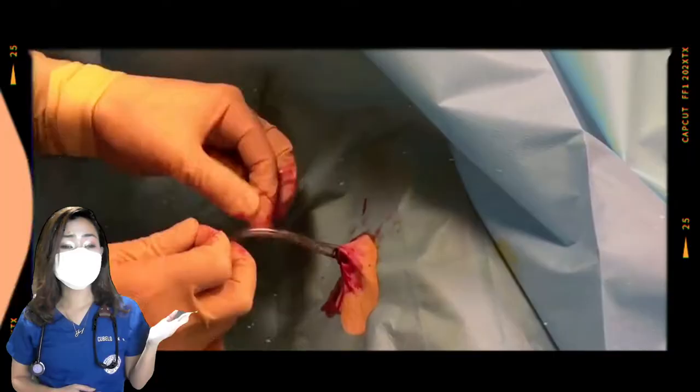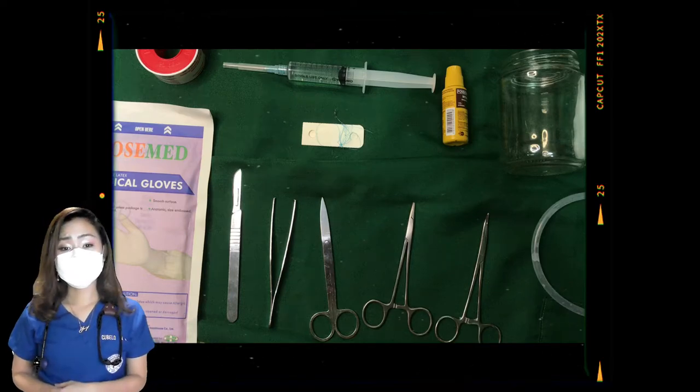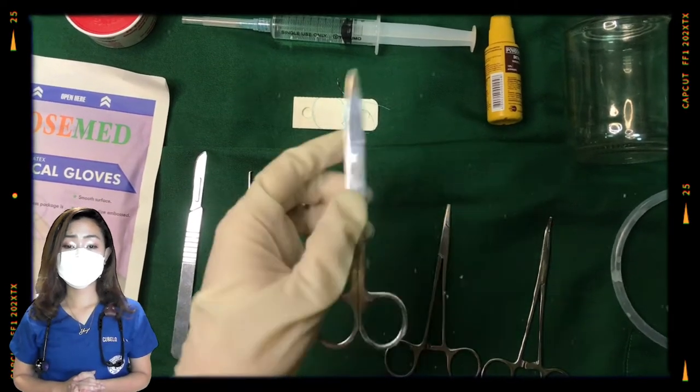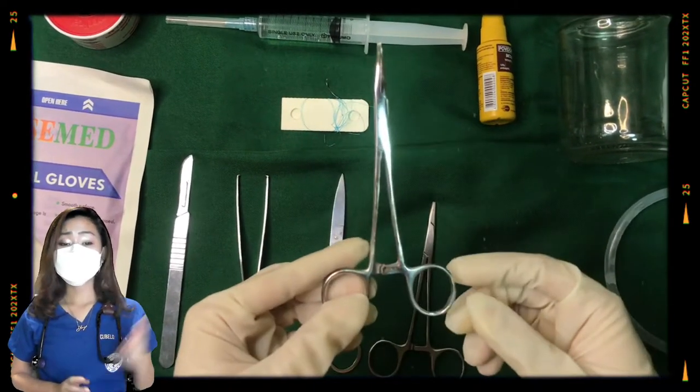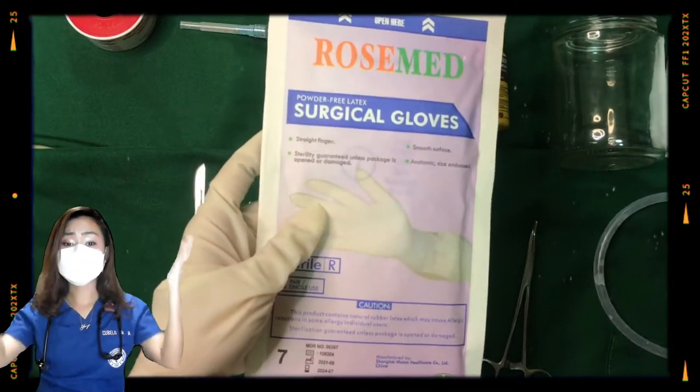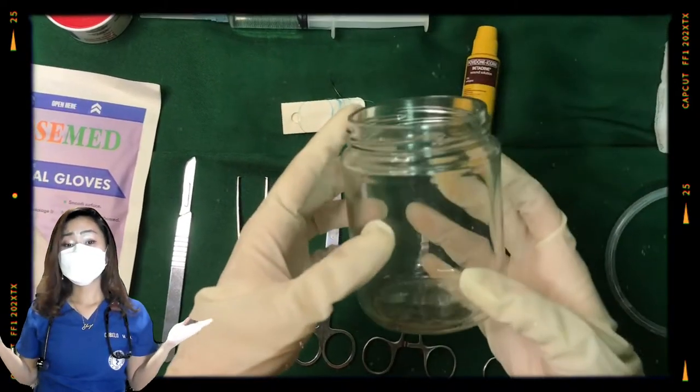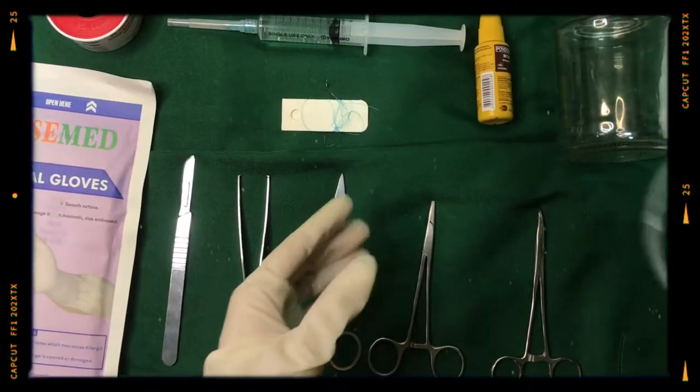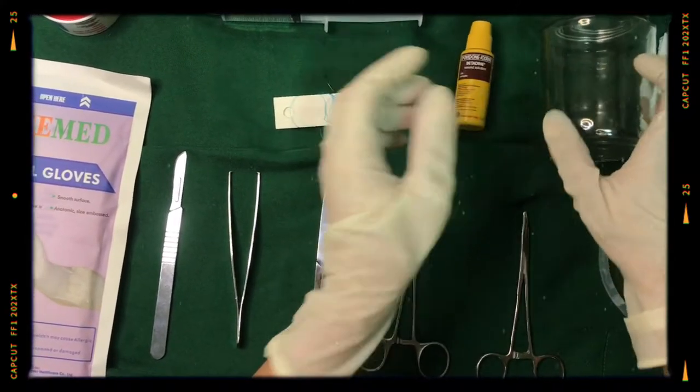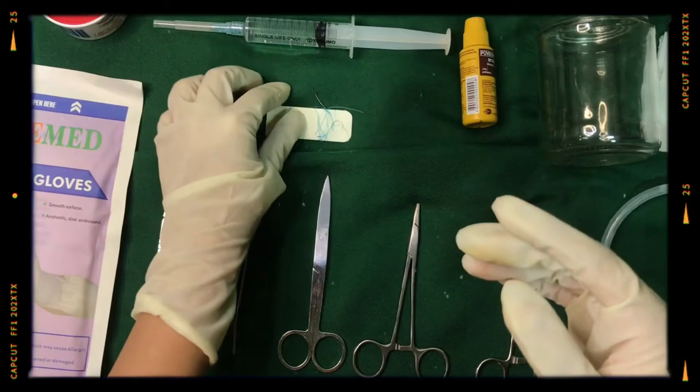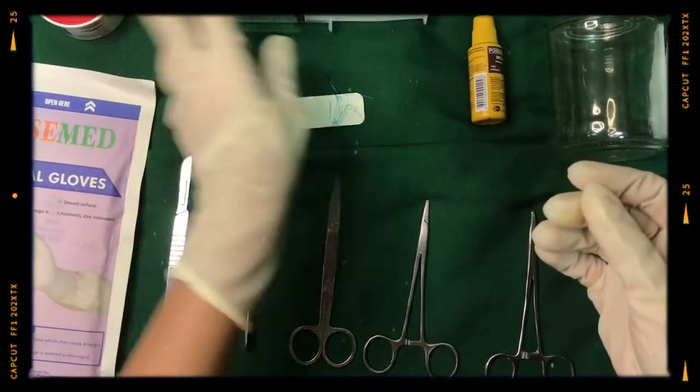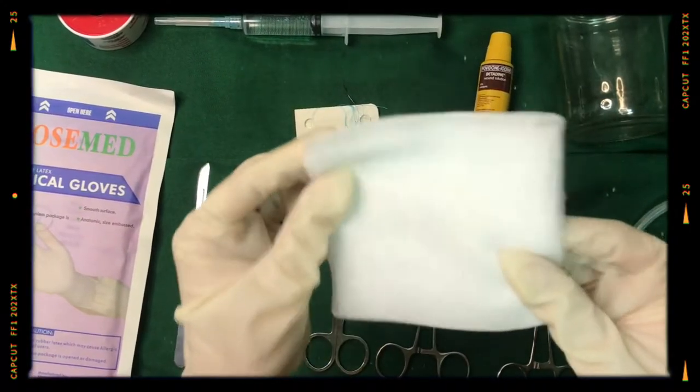For the equipment, we'll be using a cut-down set, such as a scalpel, forceps, surgical scissors, needle holder, curved kelly, sterile gowns, sterile surgical gloves, a glass bottle system with underwater seal, chest tubes, povidone iodine for antiseptic, sterile sponges, silk suture with curved cutting needle, a syringe with local anesthetic, vaseline gauze, and plaster.